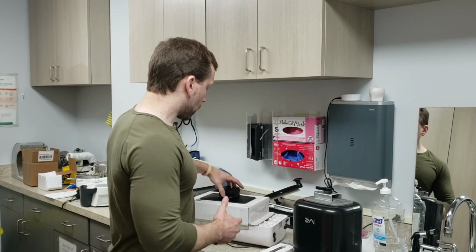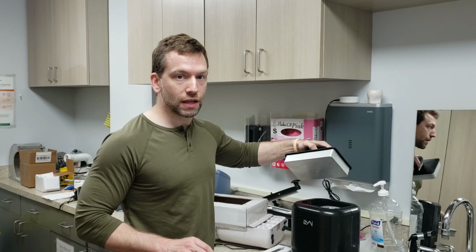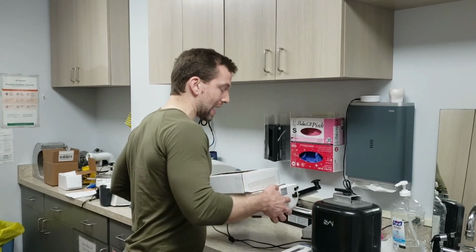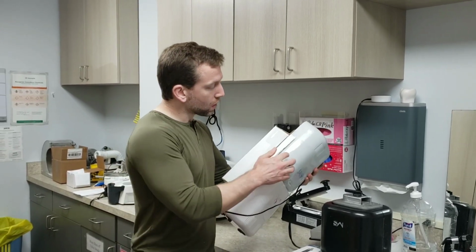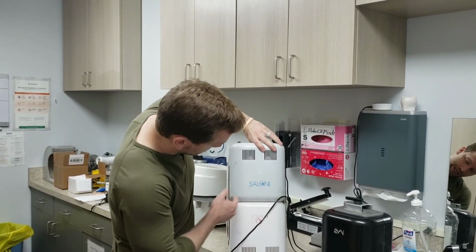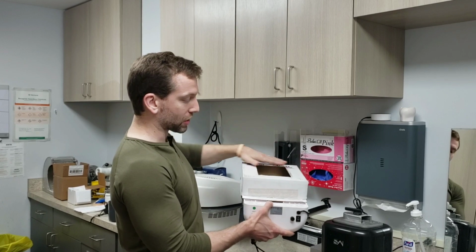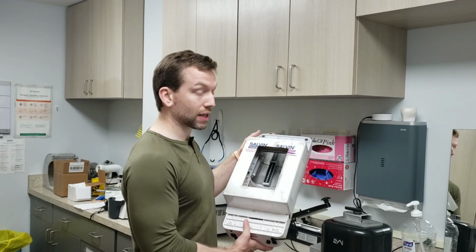Now, with the Sprintray Pro, the curing bed is much bigger, so it doesn't matter how much you grind it, it's just not going to fit in there. And so, how I keep things on there and still fit is I take the two nail curing beds, the same ones, I had these lying around, and I'll explain how that actually affected me negatively. But these two, I taped them together lengthwise instead. You can't really tell that well, but you can see the seam, two units stacked together where the openings are next to each other. So if you look inside, I've literally taken a box, just a random box that was slightly oversized. This happened to be from Salvin Dental Supplies.